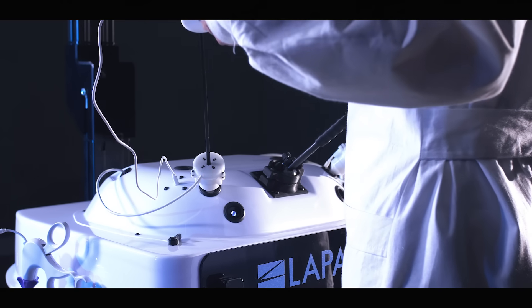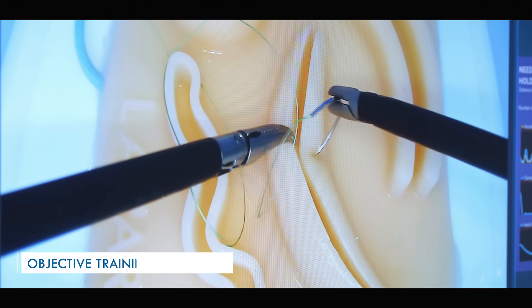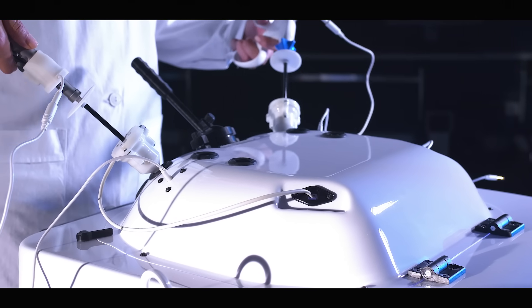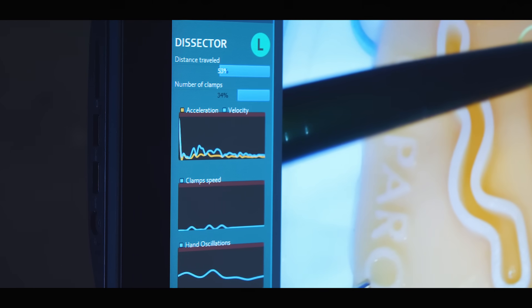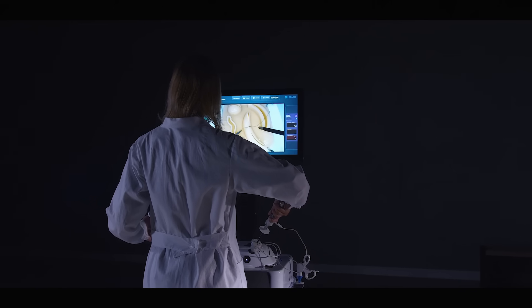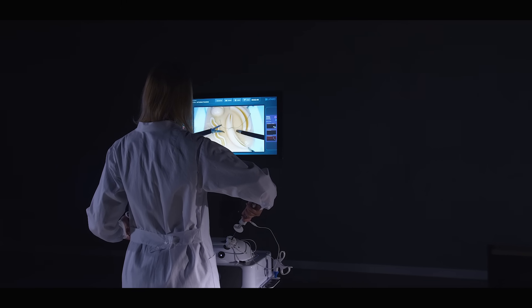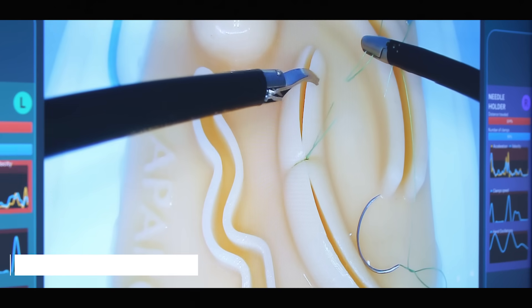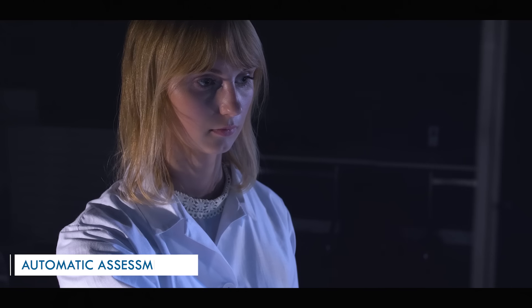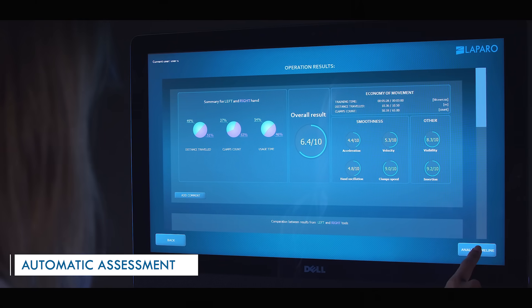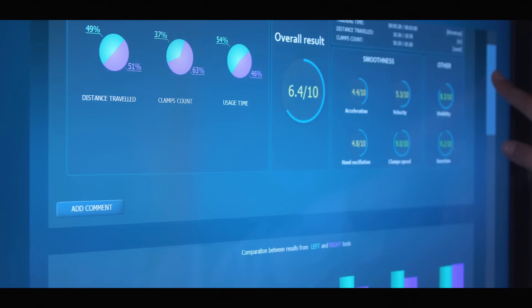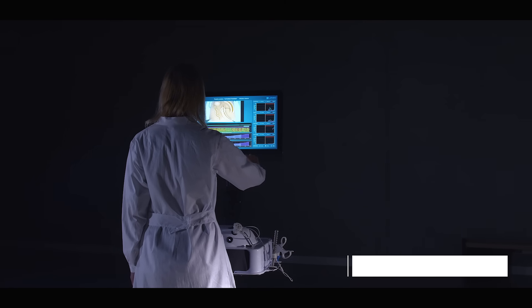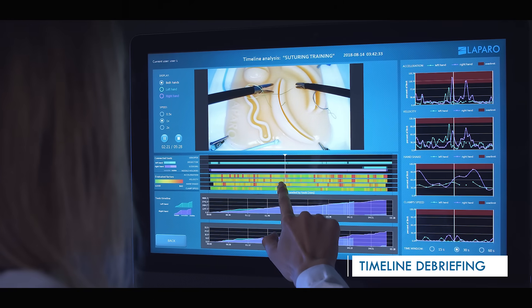The system provides an objective training analysis. Parameters such as visibility of instruments, economy of movement, smoothness, training time, and others are analysed. The user is scored based on the precision and parameters of the completed exercise. The user can also perform a debriefing by using the video timeline with automatically marked mistakes.